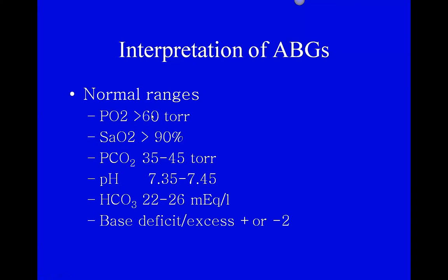The ones that I use on the quiz especially will have enough of a distinction that it will be clear to you they're either hypoxemic, or what would the alternative to that be? Hypo versus hyper. So hyperoxemic, they have excess oxygen level in their blood.